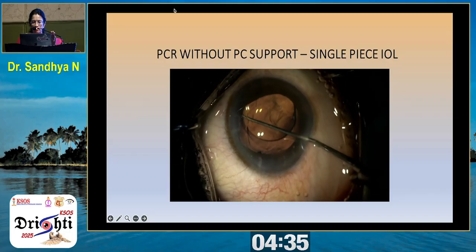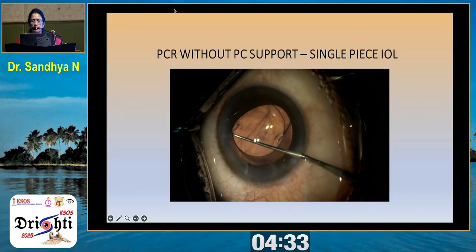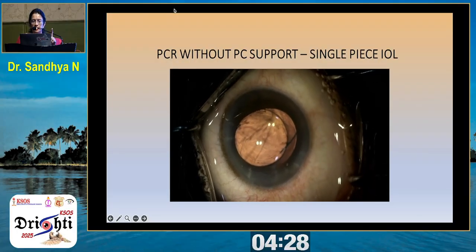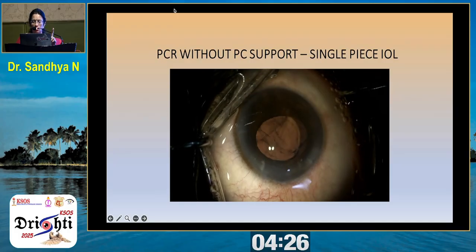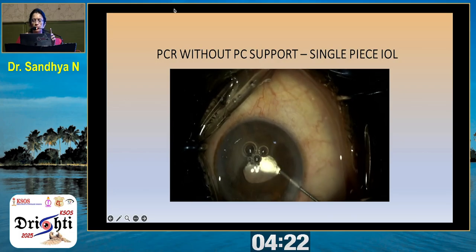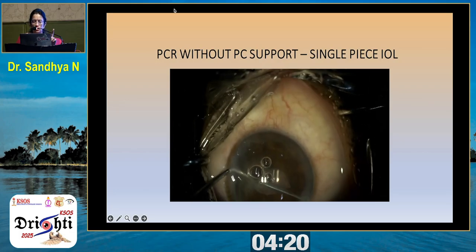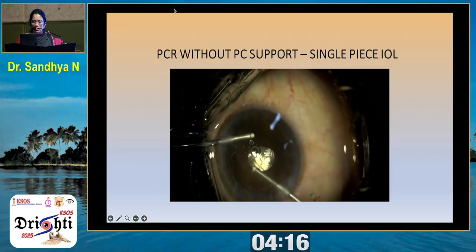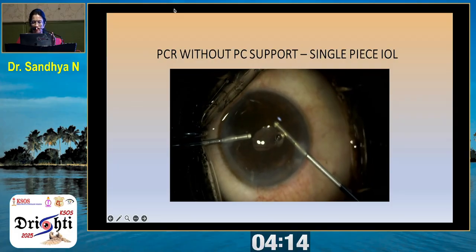the anterior chamber, and the 2 haptics were carefully placed over the rhexis margin, and then the optic was captured. Once the optic is captured, the round rhexis becomes oval shaped or spindle shaped, and when the pupil was constricted, there was peaking of pupil, as you can see here. So this indicates presence of residual vitreous strand, and this was removed by anterior vitrectomy.